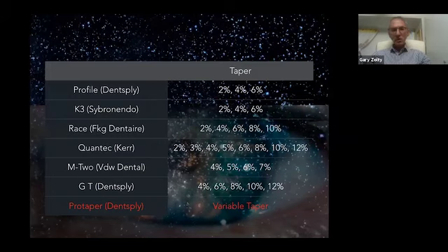I wish I could actually speak to you face to face and find out which system you're using and, you know, why. I think it would be easier if we could, in a way, stick with one taper. Like the Quantec is a little bit confusing, and I suppose people using Quantec don't find it so, but just looking at it, there's a lot of tapers to choose.